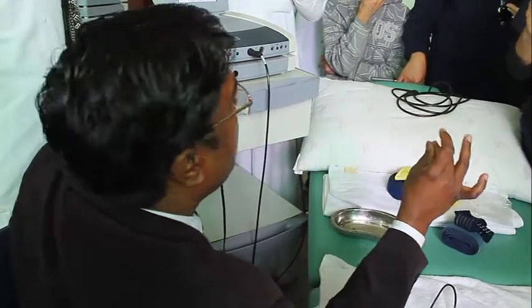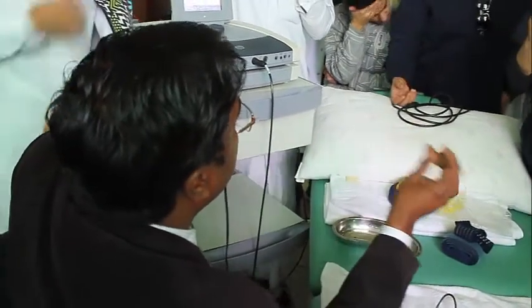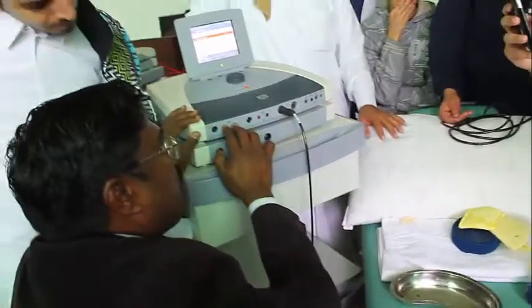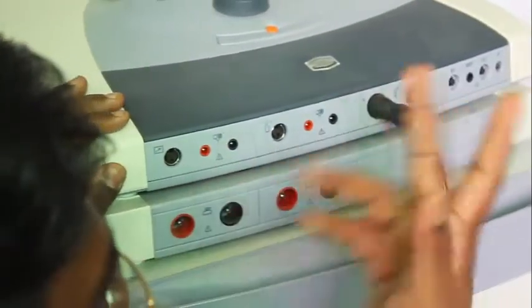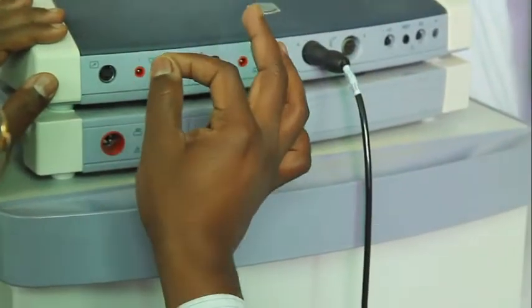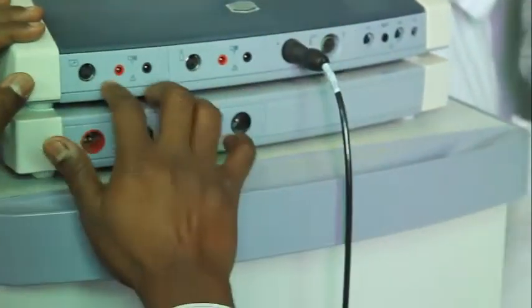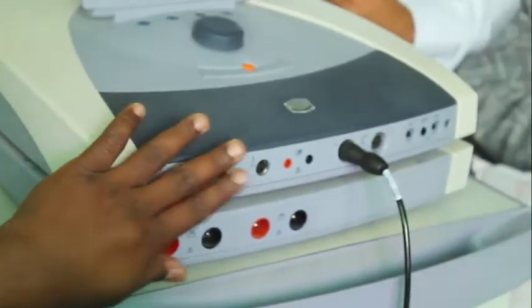If you don't feel it here, you don't feel it here, then remove. Actually, you have to put it here, on the fingers. Electrodes are deep, you cannot. Okay, so you can use the tester, the tester which glows. So the tester will glow when the current is coming here. Doctor, no problem, you can change, but you want to make sure whether this is working or not.